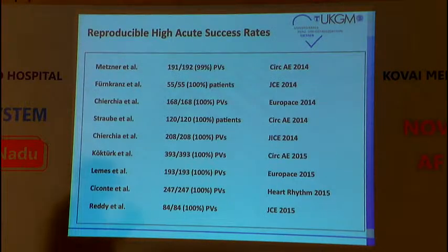This is something, the data are old, but nothing has changed on that. This is something your patient wants to know. What is the acute success? This is something the patient will also ask you. I go with AF to the hospital. Do I have AF the next day? No, because acute success is almost 100%.